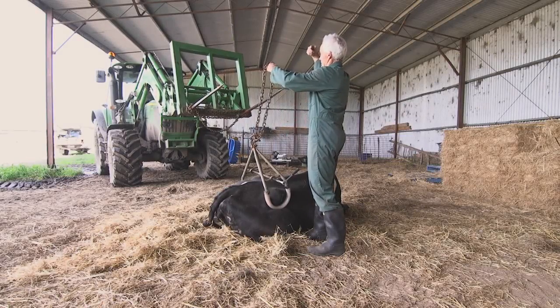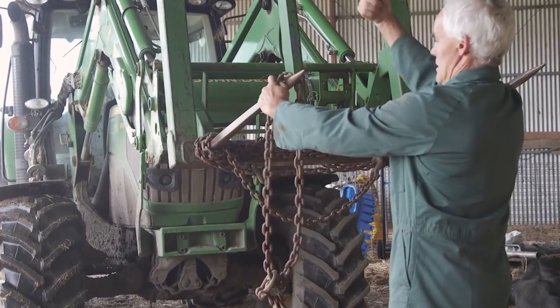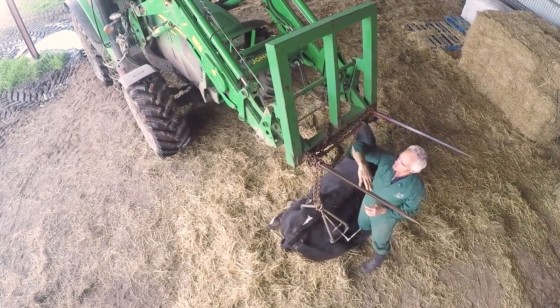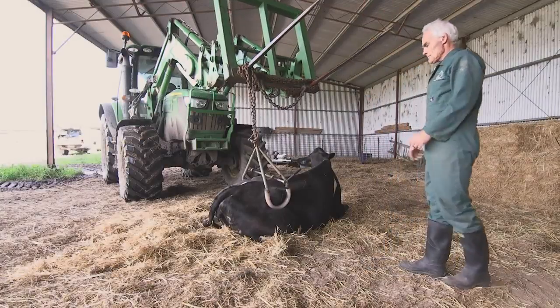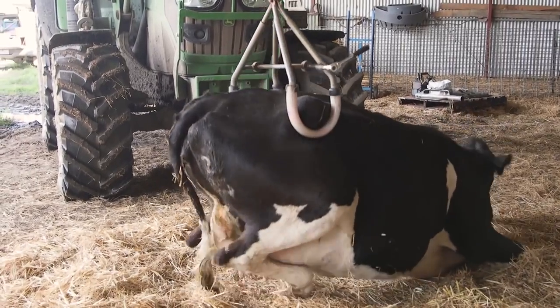Bring the tractor towards the cow and apply the chain over the forks of the front end loader, ensuring safety with good communication with the driver. The forks need to be crowded up so that the clamp won't fall off when you lift the cow. Raise the cow slowly and steadily into the standing position.